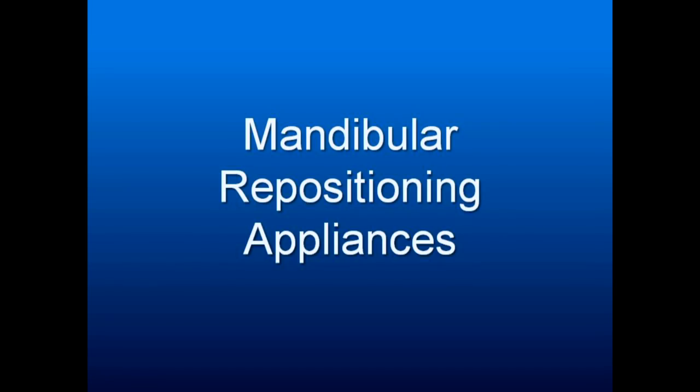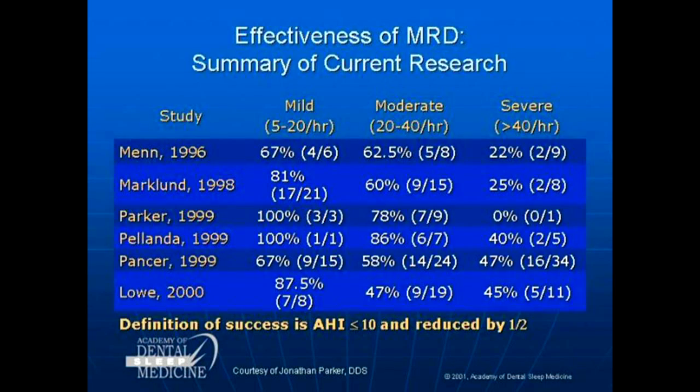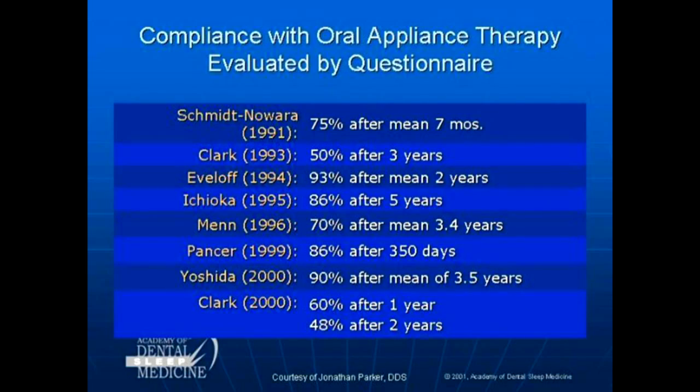Mandibular repositioning appliances: you need to be able to tell your physicians that there are studies, and in the last few years these are historical, but there are more and more studies backing up the effectiveness of our oral appliances in mild to moderate sleep apnea and their use in severe sleep apnea for enabling CPAP. We've got the studies, they work.